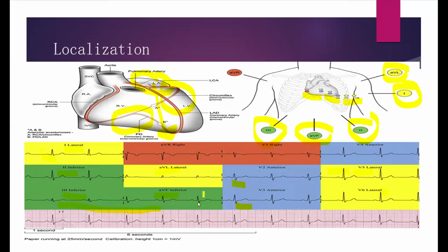Sinus tachycardia means that the impulse is coming from the SA node. The only reason for the tachycardia is a sympathetic overdrive. So you're using the normal way of calculating rate and rhythm, in that you're calculating the distance between the R waves, and counting the number of big boxes or small boxes depending on the style that you use to calculate the rate. So sinus tachycardia is a normal ECG. The only problem is the sympathetic overdrive that has led to a faster rate, such as when you're exercising, or immediately after exercise, or when you have a fever. It's physiological.